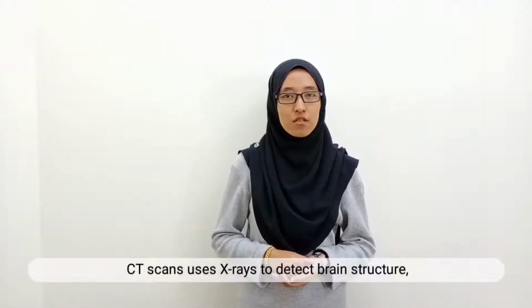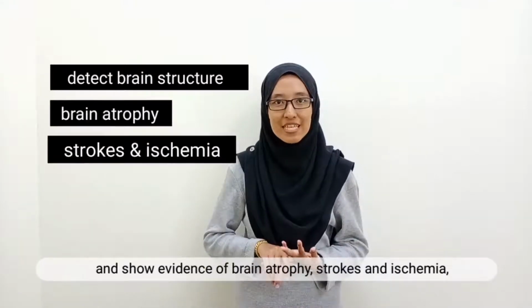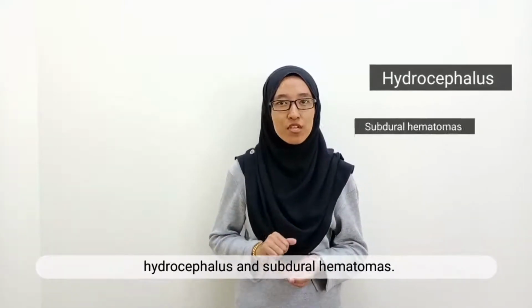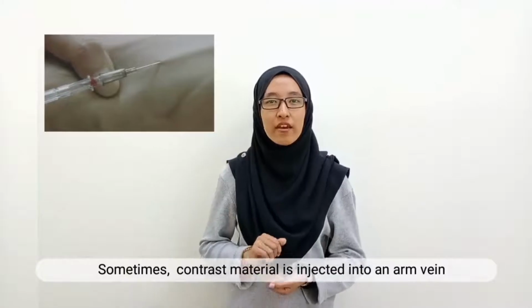CT scans use X-rays to detect brain structure and show evidence of brain atrophy, strokes and ischemia, and also detect other problems such as hydrocephalus and subdural hematomas. Sometimes contrast material is injected into an arm vein to enhance the images.